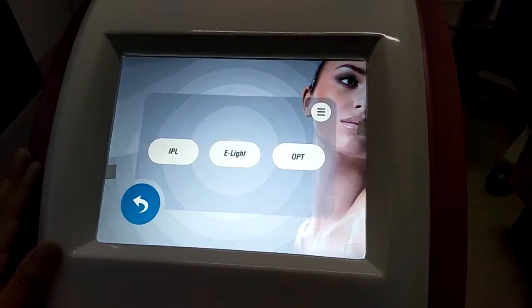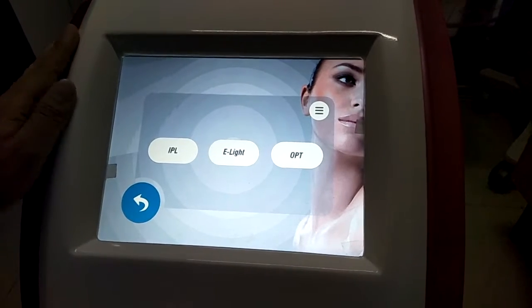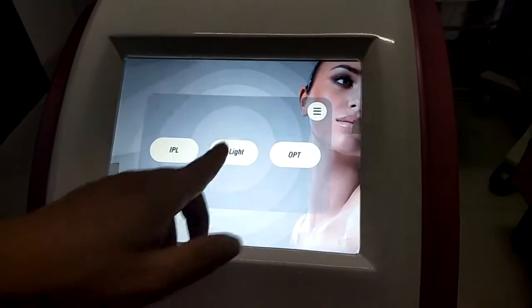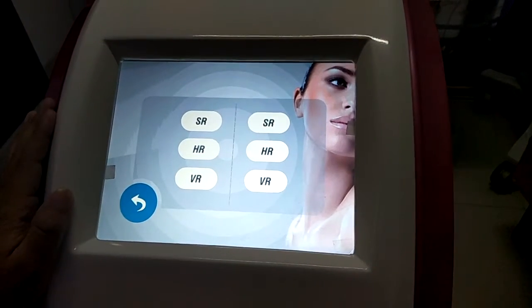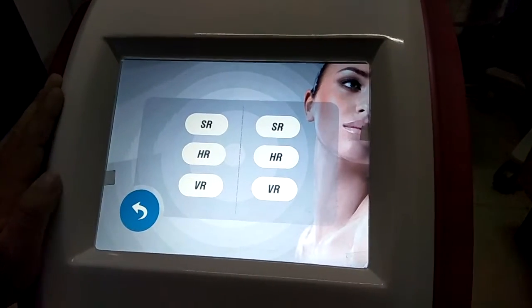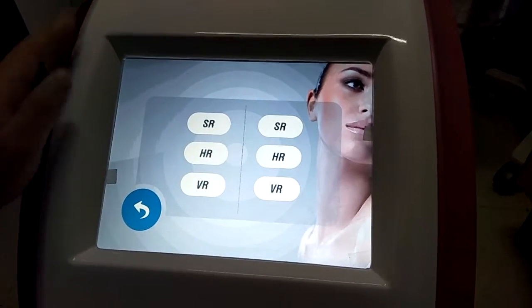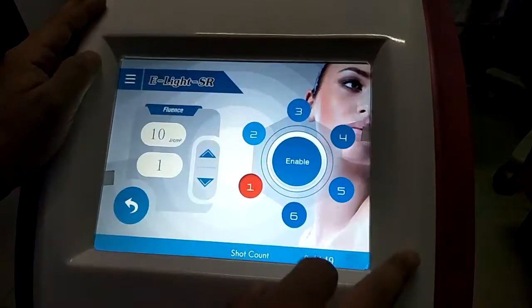We can return to the function selection and choose the E-Light function. The E-Light function is similar to the IPL function. For example, we can choose SR. The E-Light function combines IPL and RF, so its effects are better.